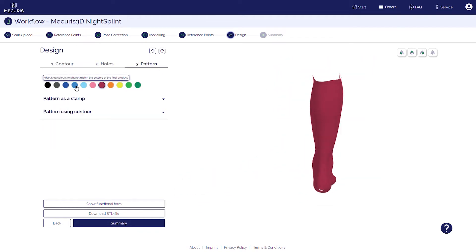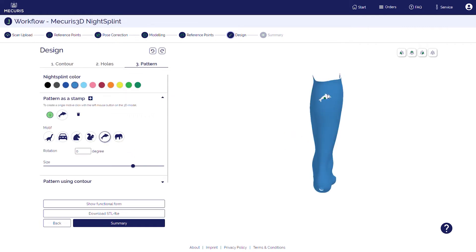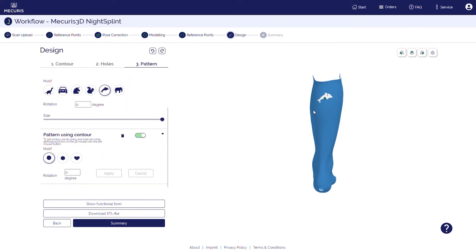Next up is the design of the orthosis. You can change the color and choose a picture to engrave into the material. Furthermore, you can define and position a perforation pattern to improve ventilation.